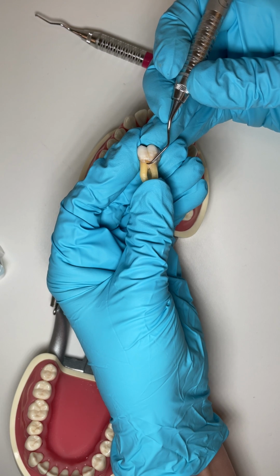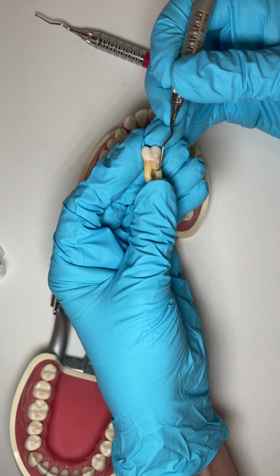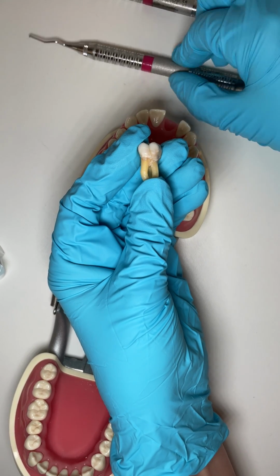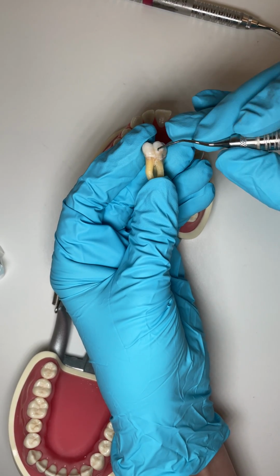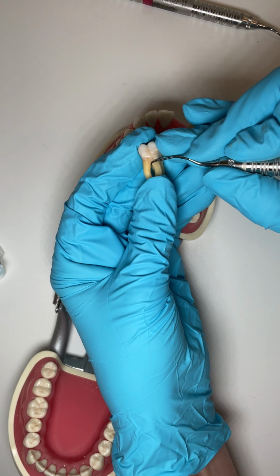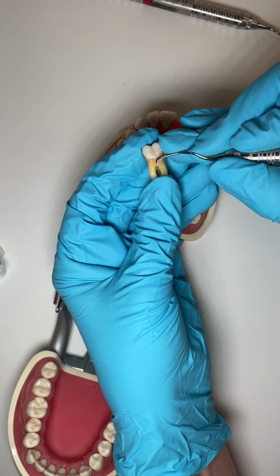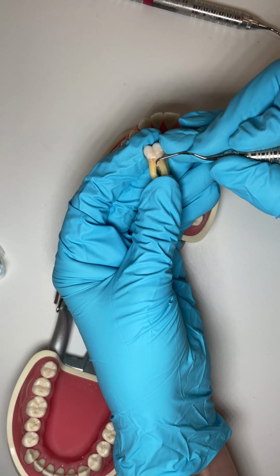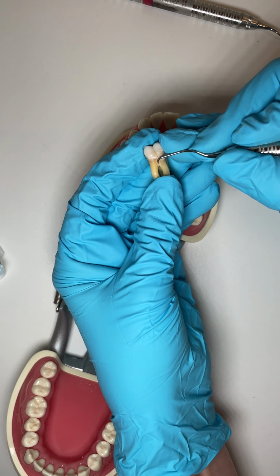Now I'm using minis here because this root surface is so narrow. It's going to be so hard to get anything with a large tip down in there to clean that furcation. So minis are super awesome for this. They also have that toe, which makes them ideal for cleaning root surfaces.